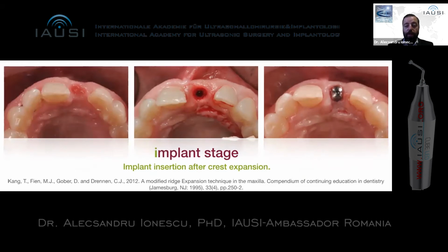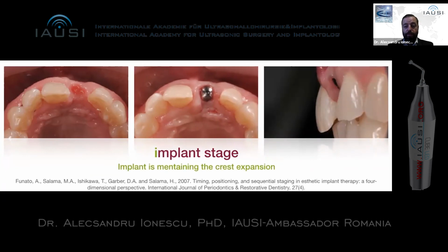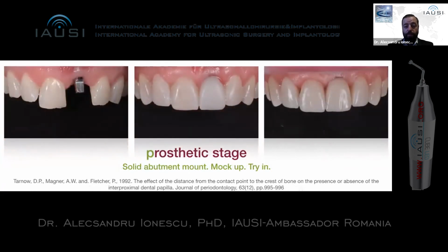Of course, we can do any buccal surgery anytime because we never ever raised a flap in that region, so we never cut the periosteum, we never cut the fixed gingiva, there is no scar there. So if we ever have the need of improving this situation, we can do it as we would before any surgery, because we never cut this region. So you can see how it looks. It is a significant improvement, not the perfect one, but a significant improvement for this minimally invasive approach.